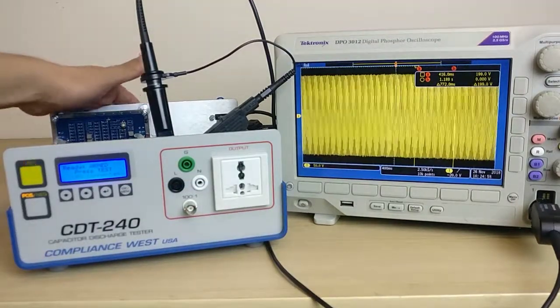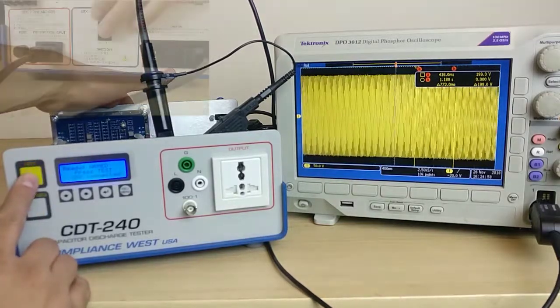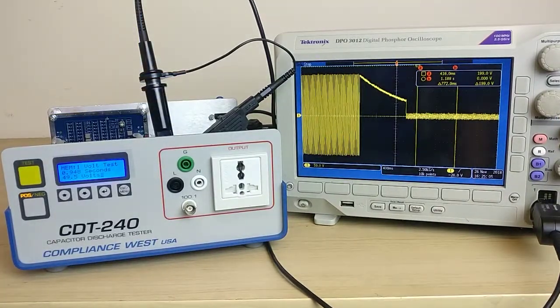I recommend using two hands for this part. We're going to go ahead and press the test button, turn off the CBX and stop the oscilloscope so we can take the time measurement.